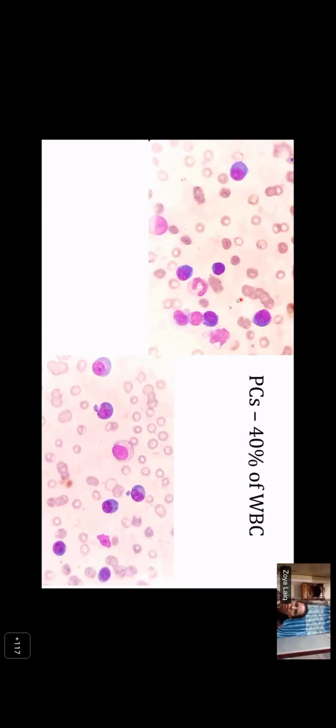So you can see there are plasmacytoid cells. There are clearly some cells even showing prominent nucleoli. Right. So you have plasma cells in the circulation, and this is the 40 power oil immersion. If you see so many cells, definitely the count is increased. And if you look carefully, almost 30 to 40% of cells look like plasma cells.